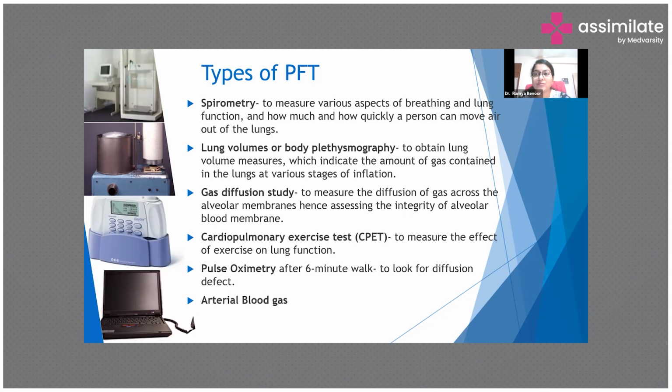I am not going to go into detail about lung volumes, gas diffusion study, CPET, and arterial blood gas because I don't think we have so much time. I will be talking in detail about spirometry and peak flow meter because that is what is most commonly used and what will be most useful for us in our day-to-day family practice as well.